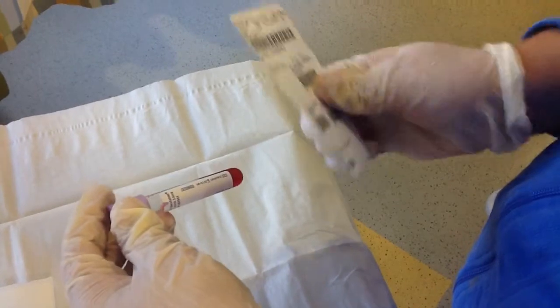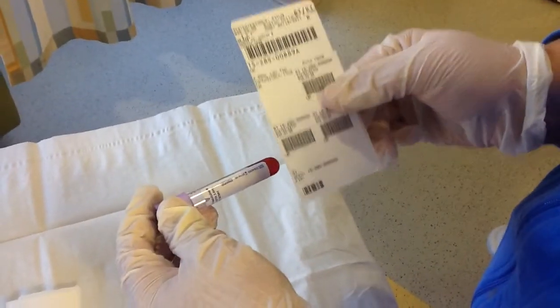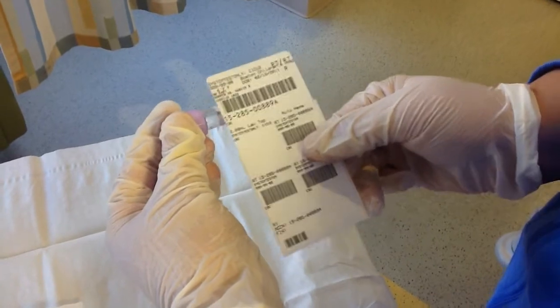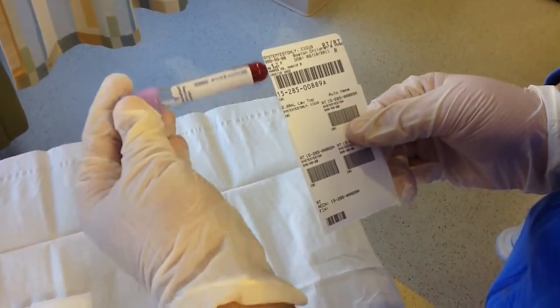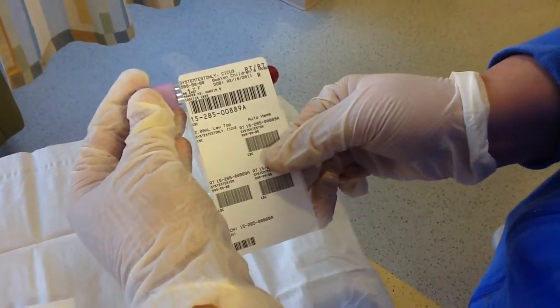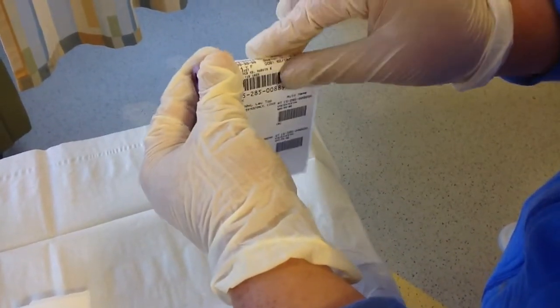To properly label a tube, you're going to peel off the top backing of your lab slip. You're going to line up the left side of the label and the writing with the cap of the tube. Here you can see the last name, System Test Only, is lined up with the lavender cap of this tube. A good trick is to place it directly over the manufacturer label. You want to make sure you leave enough distance between the cap and the bottom of the tube.